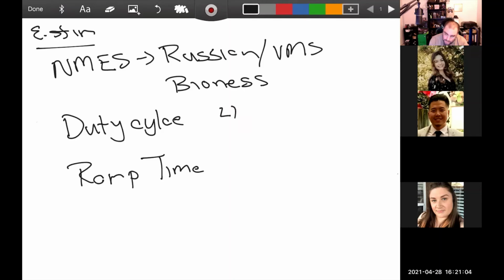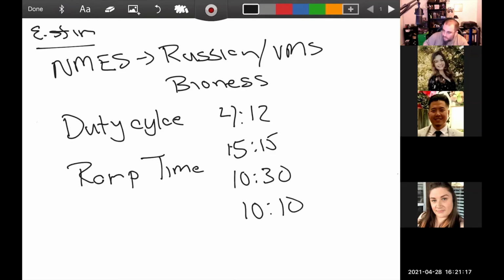The duty cycle, you'll often see something like 4 to 12, 15 to 15, 10 to 30, 10 to 10 are some of the common duty cycles. You guys remember seeing that on the machines? Yeah. Right? So what this means is this is the on and off time. So if I have a 4 to 12 ratio, what that means is the machine is going to be on for a full 4 seconds. And then they have a 12-second rest. And then on for 4 seconds. And then a 12-second rest.